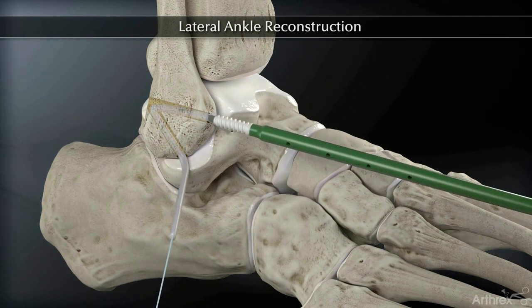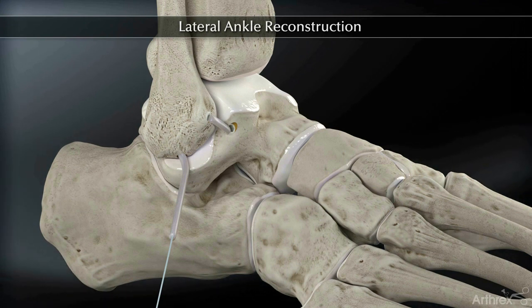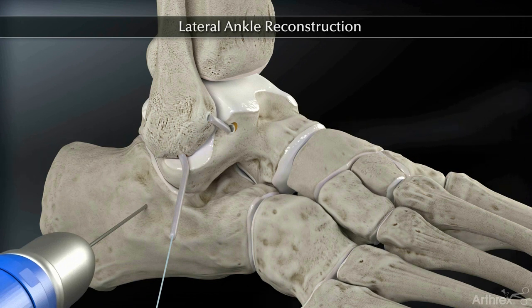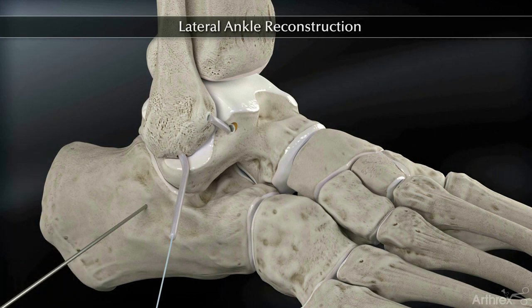Pull tension on the free end of the graft and insert a 4.75 mm biocomposite tenodesis screw. When making the final tunnel for the calcaneus, place a 2.4 mm tenodesis guide wire 16 mm from the peroneal tubercle.